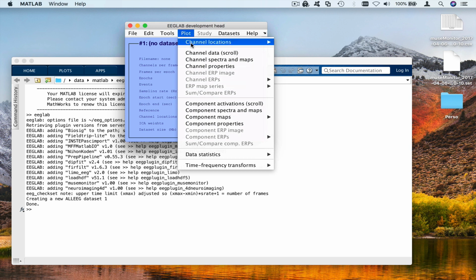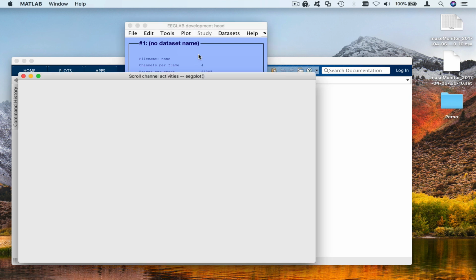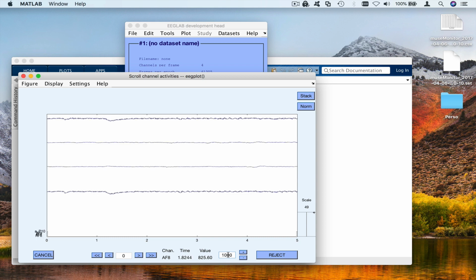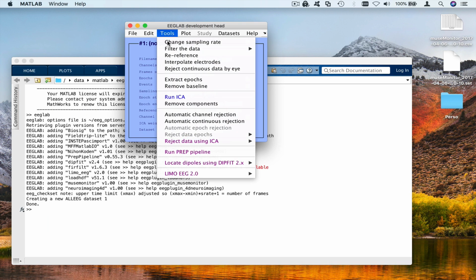And first I'm going to plot the data. So to do that, you do plot data, plot channel data. And you can see it's empty here because they're all offset. If I increase the scale, for instance, to 1000, you can see this is AF8, AF7, etc. So they are offset. So to remove the offset, what we do is we go to this menu Tool, Remove baseline.